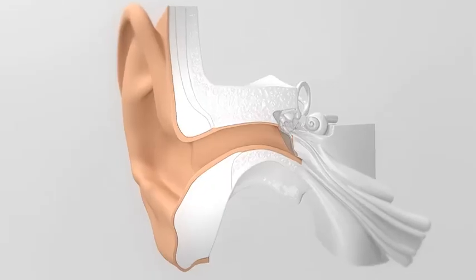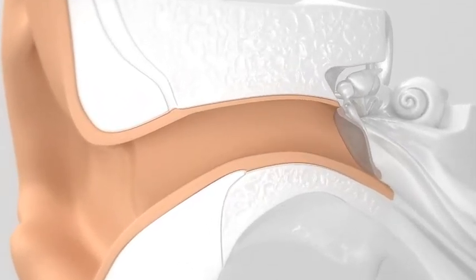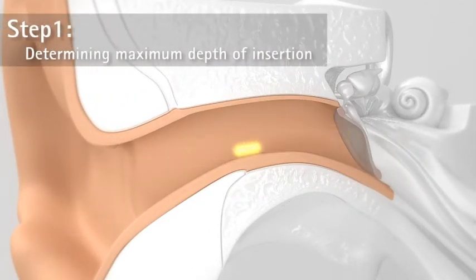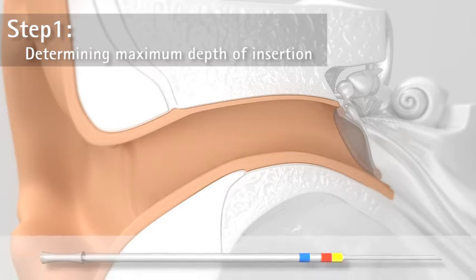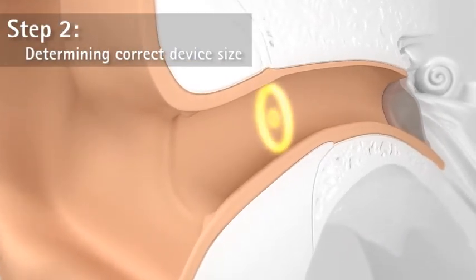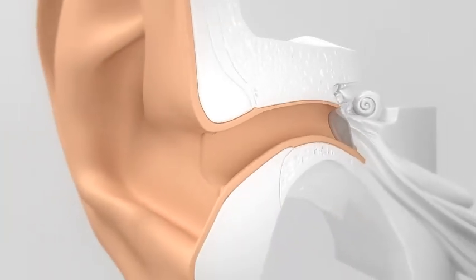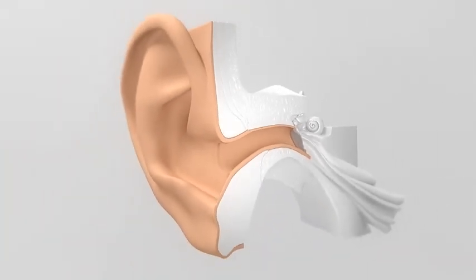The sizing process for Lyric is a 2-step process. In the first step, the maximum depth of insertion is determined using a length sizer. In the second step, the Lyric device sizers are used to determine the correct device size. Complete both measurements on one ear before continuing with the other ear. After successful sizing, Lyric can be immediately fit.